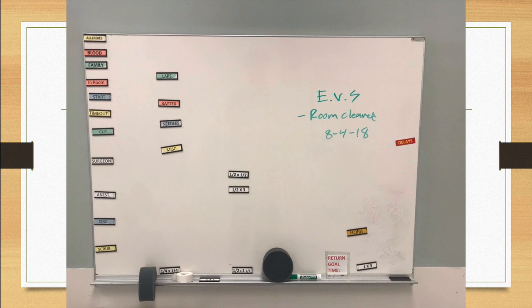Before we get into the nitty-gritty of MSMAIDS, right when you walk into the OR, you're going to see some version of this whiteboard. And if you've seen any of the other videos that I've done, you'll know that I emphasize introducing yourself to the person that's in the OR. Usually the circulator nurse is there first. You can ask them if you can write your name on the board under anesthesia as visiting student, and then you can move on to MSMAIDS.